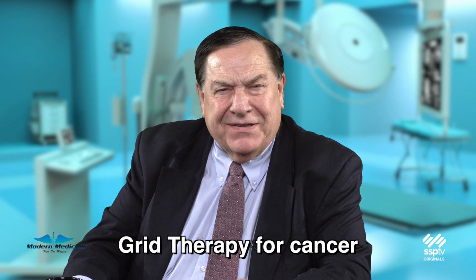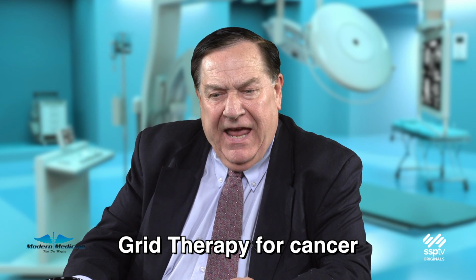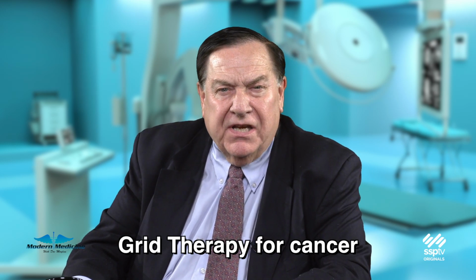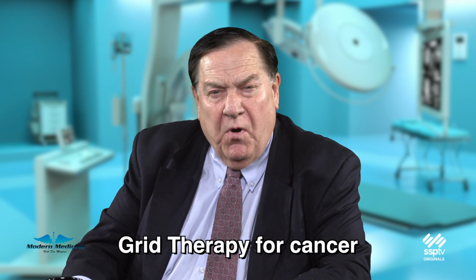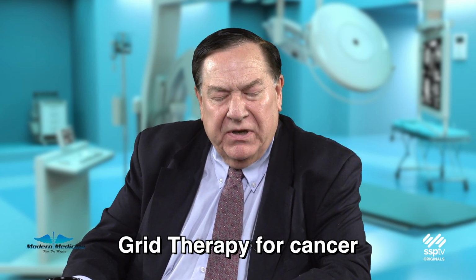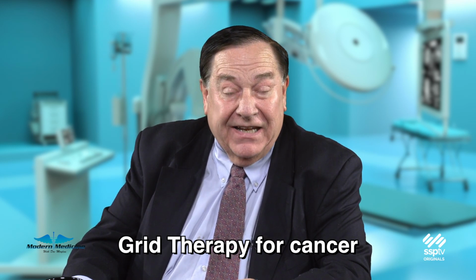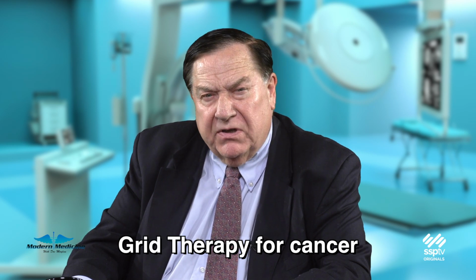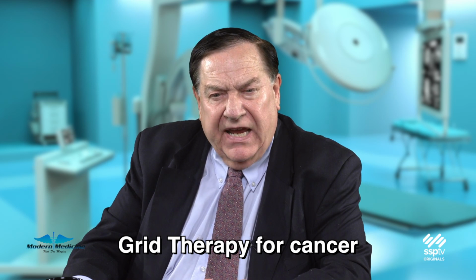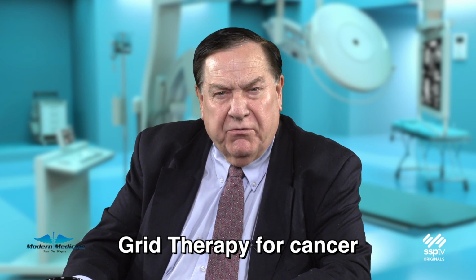We apply it to about 10% or so of our patients with larger tumors. And it was invented by one of my professors at Jefferson Medical College. His name is Dr. Mohammed Mohyuddin, and he invented the grid while he was at Jefferson. We used it quite a bit. And at the Kramer, which opened in 1998, we acquired a prototype of the grid, and Dr. Mohyuddin's team, at that time at the University of Kentucky, calibrated the grid for us.